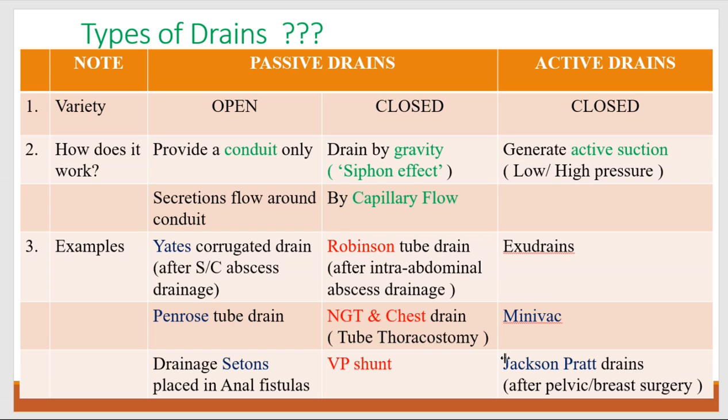or after breast surgery, right? Mini vac can be utilized even in thyroid surgery or during various plastic surgery procedures, right? These things can be utilized.